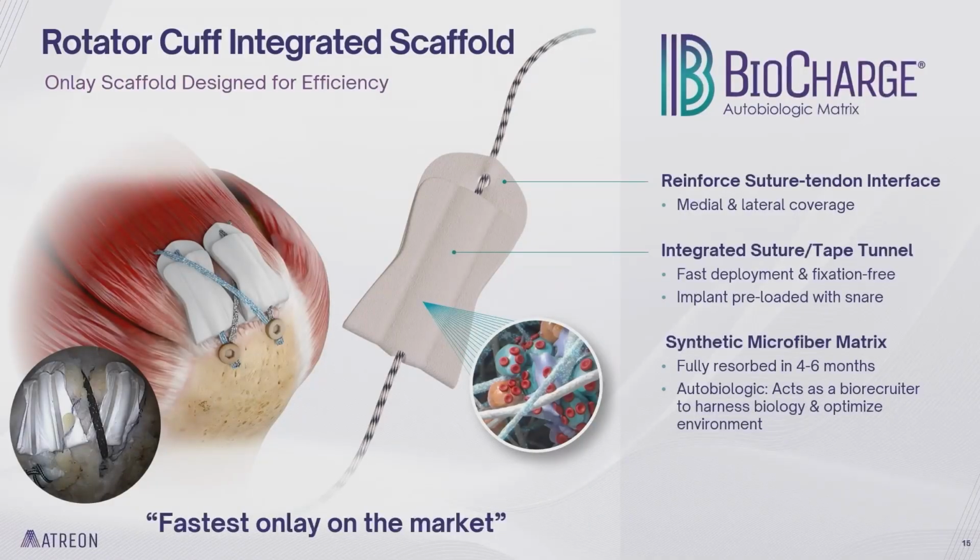So usually, and we're going to speak about exactly what's in this wick, but they have an ability to do an onlay, which is very simple. You go right down your sutures, and it's adding medial lateral coverage, so expanding your coverage. I think it's probably allowing the forces to expand over your rotator cuff, so you're not getting such punctate forces on the rotator cuff. It's fast, it's easy, and it fully resorbs.